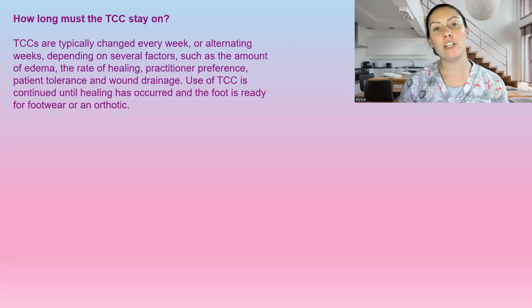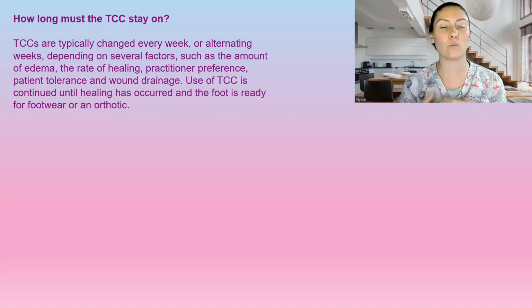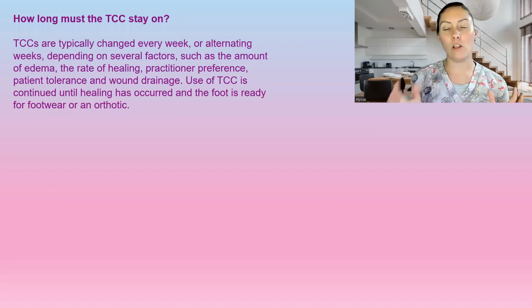So how long does somebody normally stay in total contact casting? They're changed out weekly, sometimes bi-weekly. It depends on several factors, such as the amount of edema or swelling in the leg, the rate of healing, practitioner preference, patient tolerance, and wound drainage. Okay, so all those factors will come into play. Now, we will use total contact casting until the foot has healed, the ulcer has healed, and the patient is ready to go in orthotics or specialized footwear.